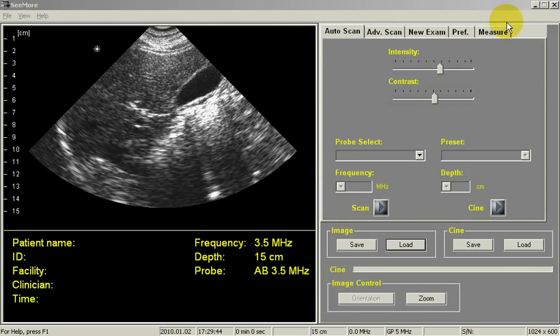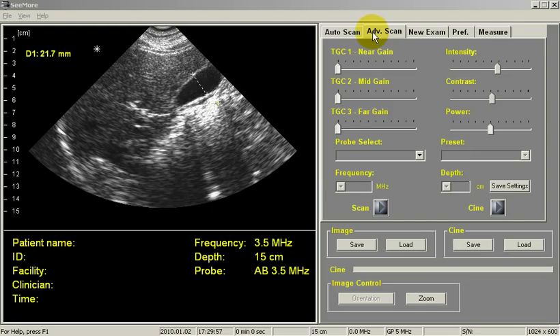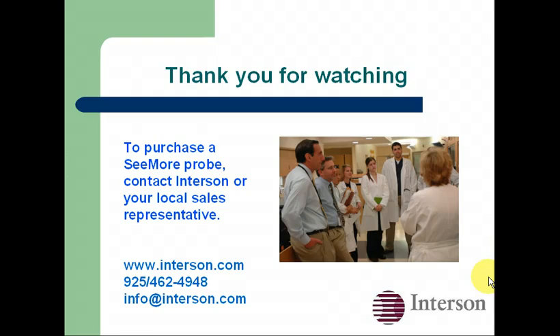We can even do some measurements on this image by right-clicking and dragging and releasing the mouse button, and it will give us a measurement. We also have other tabs for advanced scanning, TGC controls and the like, but those are only used when you have a probe plugged in. The new exam tab allows you to create a patient folder for your exams, and the preference tab allows you to input facility and physician names and things like that in advance. If you download cine images, you'll click the load button here on the cine side rather than the image side. So that's all there is to it.